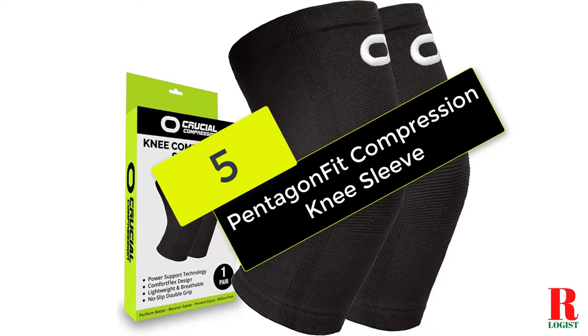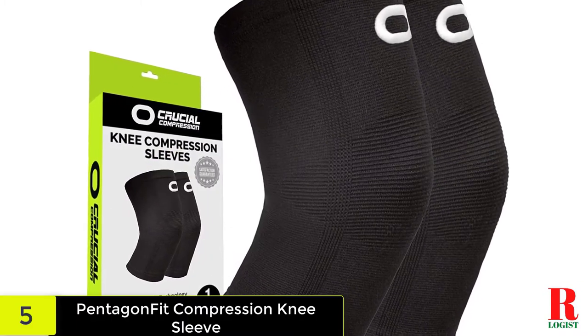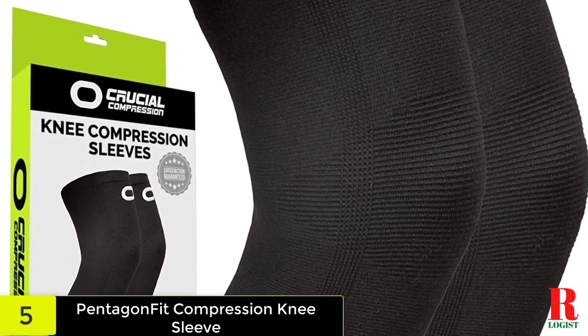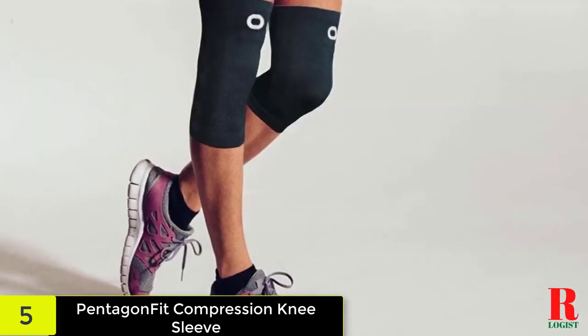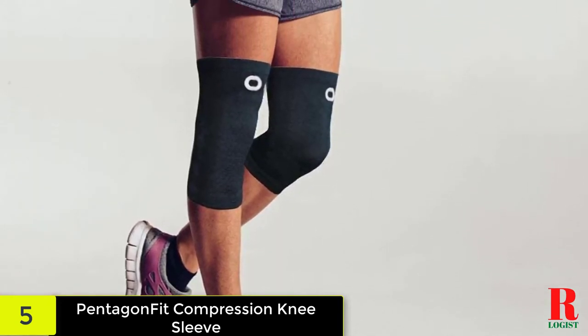Starting at number 5 on our list, we have the Pentagon Fit Compression Knee Sleeve. Hyperextension can cause unintentional pain when moving your knees. The cause of this ailment can be as simple as a recent injury or a lifelong disability. A Pentagon Fit Plus Size Compression Knee Brace will help relieve the tension and keep your knee in the correct place.